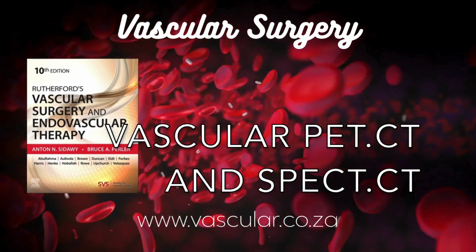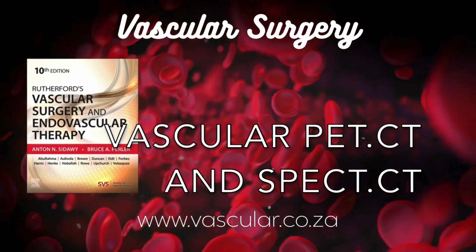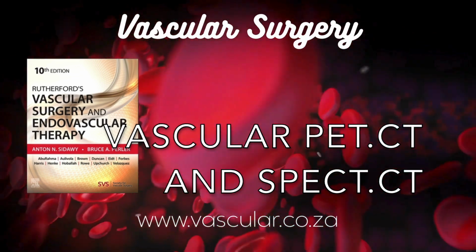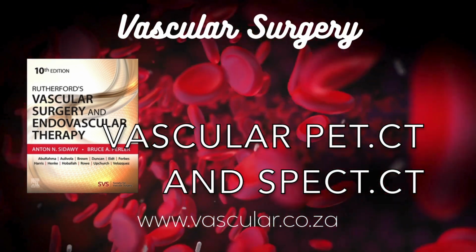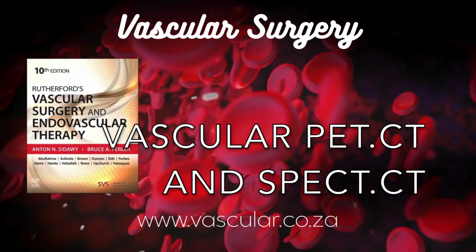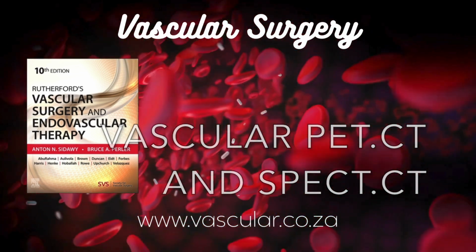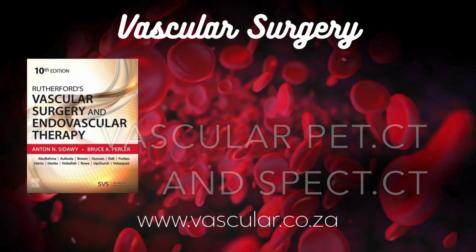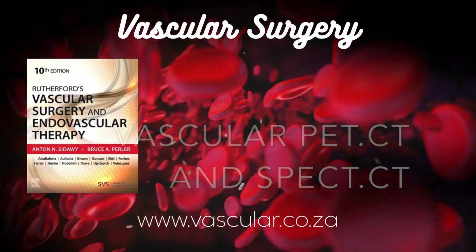So a more precise signal. Much more precise, better spatial resolution. We're talking maybe 3 to 4 millimeters. Plus, PET tends to be easier to quantify. We can calculate something called an SUV, standardized uptake value. SUV, like the car? No. It's basically a measure of how much tracer has accumulated in a specific spot, corrected for dose and body size. It gives us a number, a quantitative measure of the metabolic activity. Oh, it's useful. Numbers are good. And you mentioned fluorine-18. Yes, 18F is a very common positron emitter used in many PET tracers.